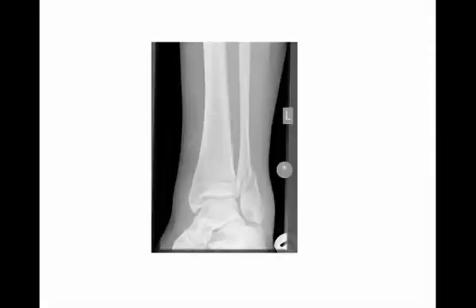Here we can see a radiograph of a patient's left fibula, or ankle joint. It's in the distal third of the fibula, probably oblique in nature. However, we can't comment on the displacement because we haven't got a lateral view.